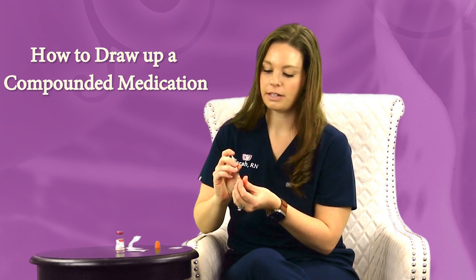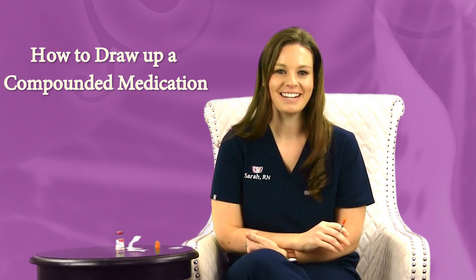You'll then dispose of your syringe after that. And that's how you draw up a compounded medication. Thank you very much.